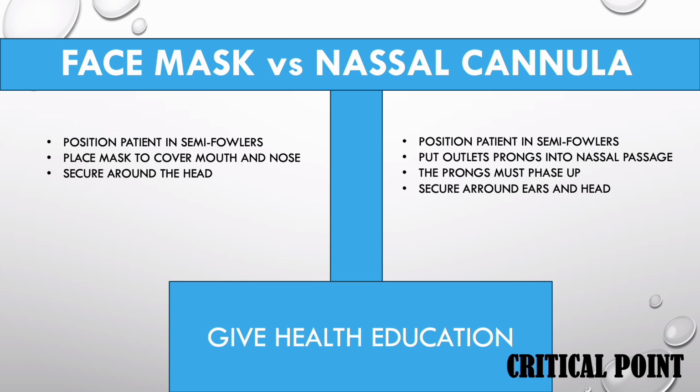If you are using a nasal cannula, the same applies. Position your patient in a semi-Fowler's position to allow airflow. Put the outlet prongs into the nasal passage, making sure that the prongs are facing upside. Secure around ears and head to allow enough air.